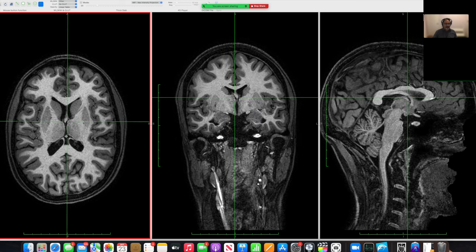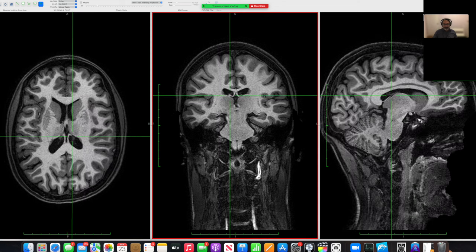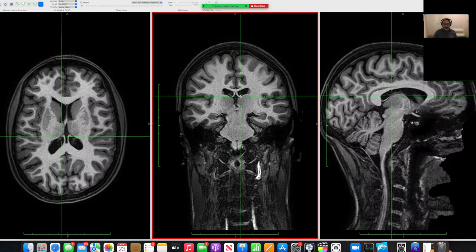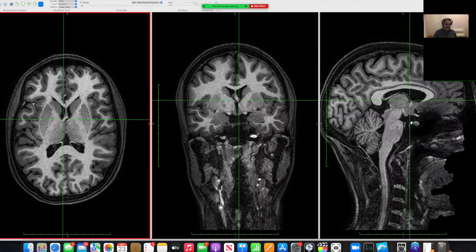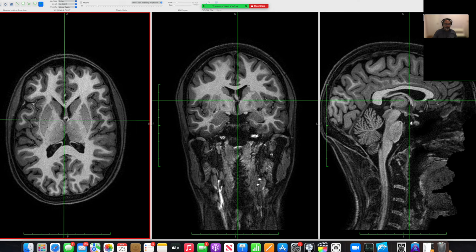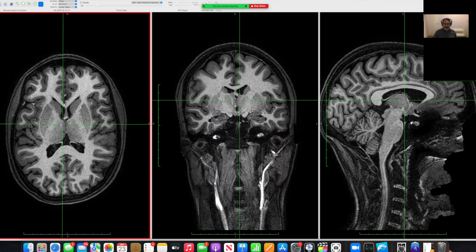Now I'm going to click here. Now when I click here, have a look where that is there. And have a look where that is there. So that's where your third ventricle is. So that's your third ventricle there. That's your third ventricle. And you can actually even see the foramen of Monroe on both sides. And it's there too. Like if the foramen of Monroe is anterior. So if I'm clicking there, that's a bit more anterior. But the foramen of Monroe continues on posteriorly also.